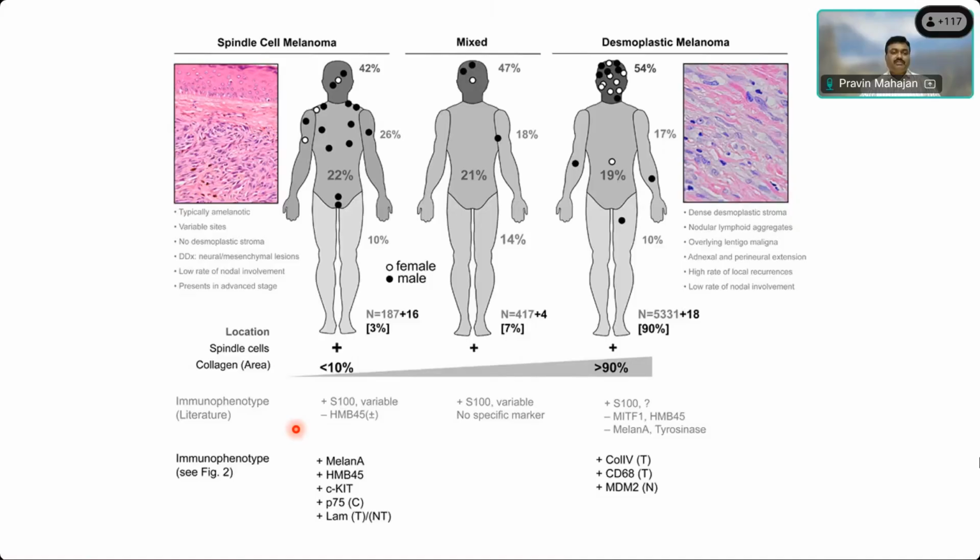Mostly the tumors which have more epithelioid morphology or rhabdoid or plasmacytoid morphology will show you nice nucleoli, as opposed to more spindle ones. That's why they are difficult to diagnose. And desmoplastic are more difficult to diagnose because they are very hypocellular and have a lot of collagen. But these are the two types which usually occur at the cutaneous site. You can have these differentials when a melanoma shows spindle morphology: one is spindle cell melanoma, the other is desmoplastic melanoma.